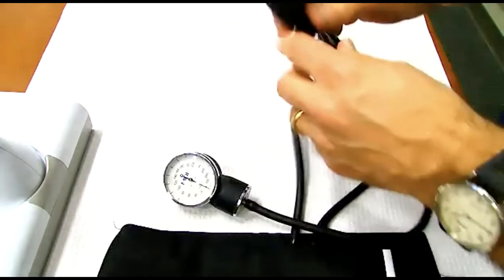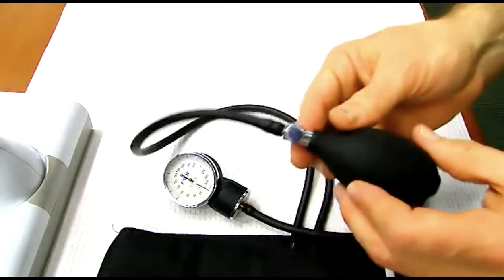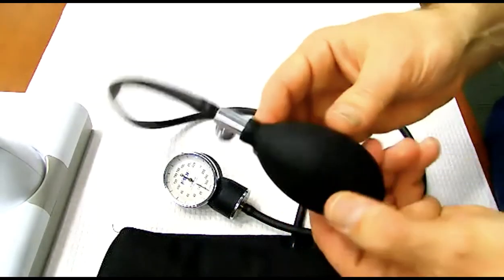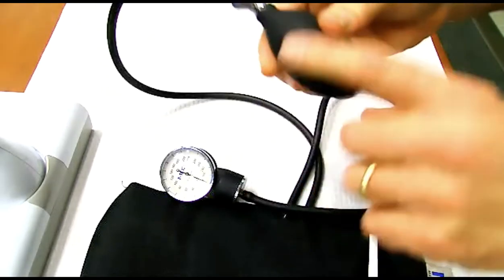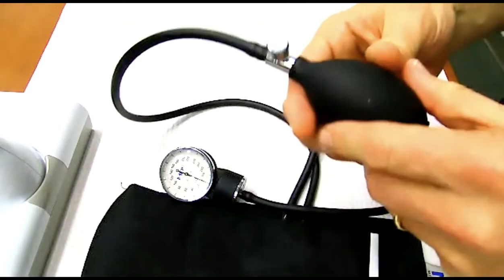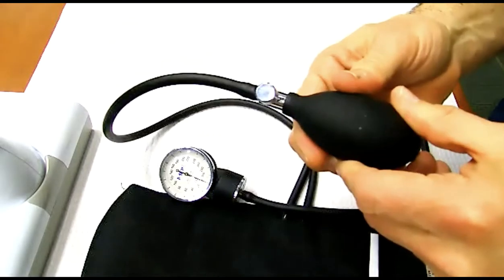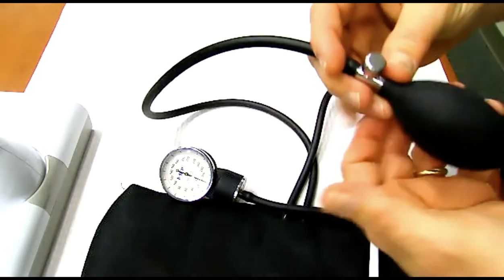Let's talk about the other active piece here, the bulb valve. And this one I do want you to hold and play with. This bulb valve is essentially going to squeeze and put air into the bladder inside the cuff. So we want to be able to push air in, but we also need to be able to let air out, and that's what this little roller knob is for. So really go ahead and practice this.